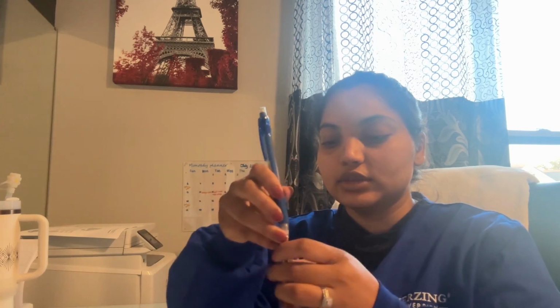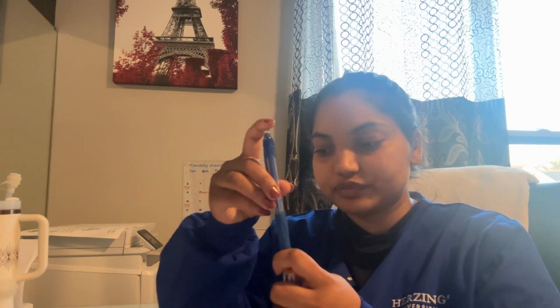injection. It is 25 to 27 gauge, and I'm gonna draw 0.1 ml. So I'm gonna draw the air into the syringe, which is 0.1 ml, and then I'm gonna insert it into the vial and push the air inside the vial and invert the vial and withdraw the correct dose.